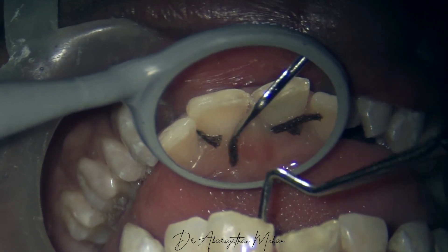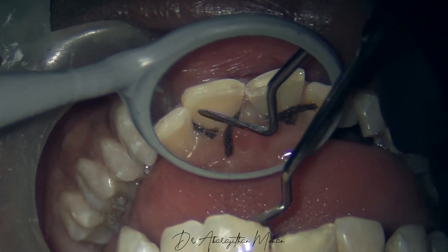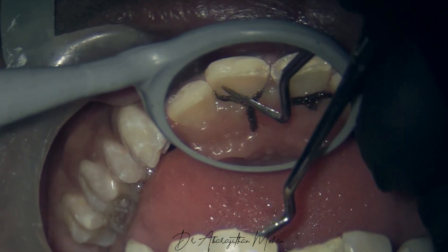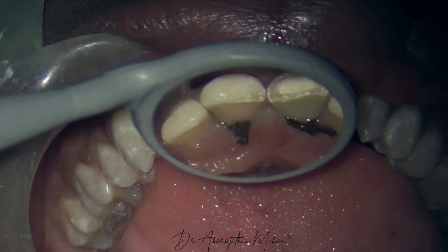If you're going to do a crown preparation, I would pack the retraction cord even on the palatal side following palatal soft tissue anesthesia. But like I mentioned, this is just a veneer prep, so I'm not pushing it deep enough on the palatal side.